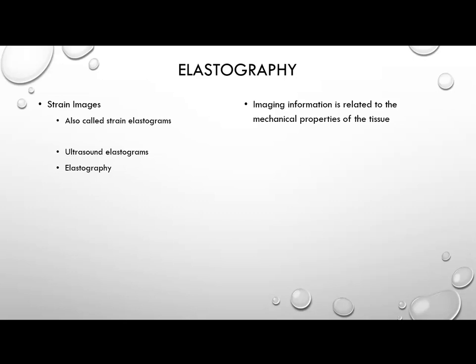So elastography is also known as strain elastograms, also known as ultrasound elastograms, and more commonly called elastography. The imaging information is related to the mechanical properties of the tissues.